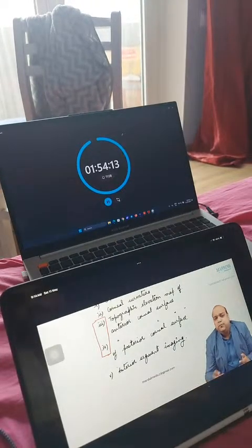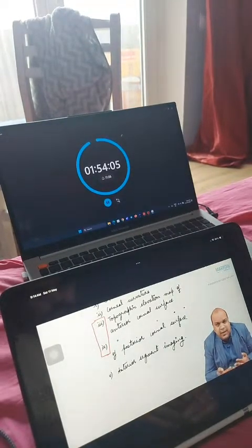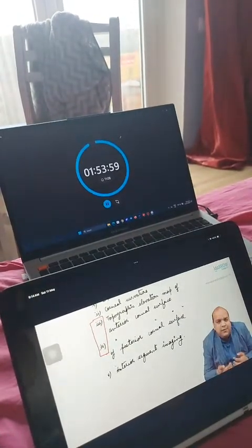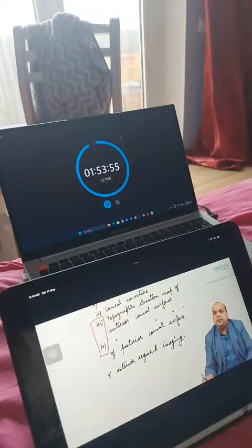Pentacam is usually done before a case of LASIK surgery is done. If we have a keratoconus, we want to see the progression. Keratoconus is a cone-shaped cornea. So whether the cone is progressing or not, if the cone is progressing, the topography will change. So in a lot of conditions like this where we have any shape or surface abnormality of the cornea or we are about to do a corneal surgery, we always tend to do Pentacam before those things. Am I clear to everybody? Done? So that's all about our third investigation, that is topography.